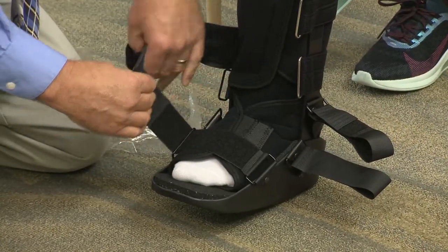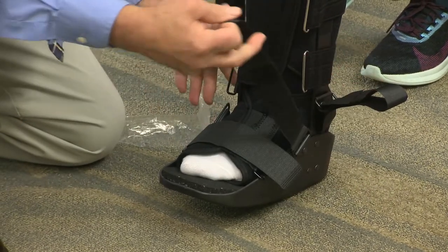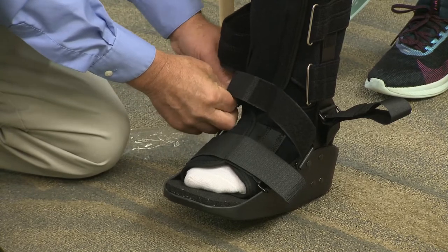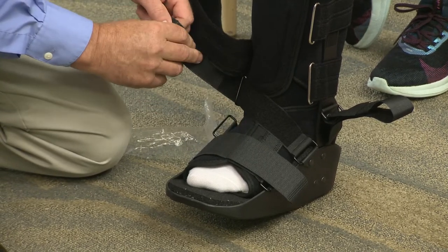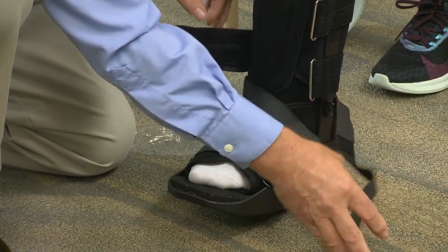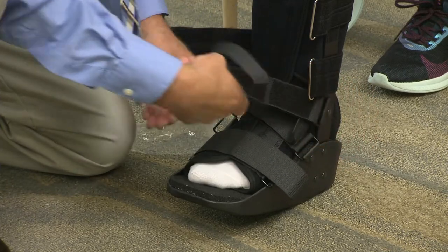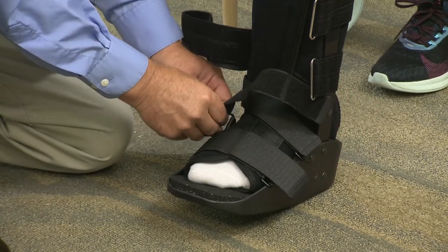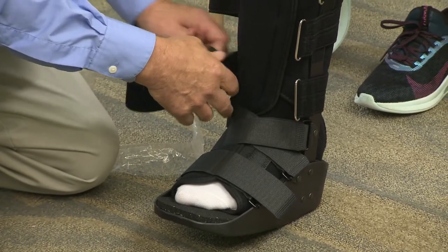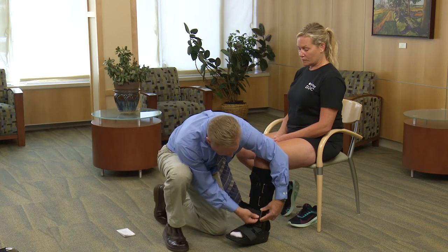Patients, I would prefer that you wear a knee-high stocking. We're crossing these here. To spend six weeks in a boot, your boot will smell like a gym. Not only that, and more importantly, you may get fungal infections associated with being in your boot. Oftentimes, we in orthopedics will give you several stockingettes just to make sure that your skin is protected.